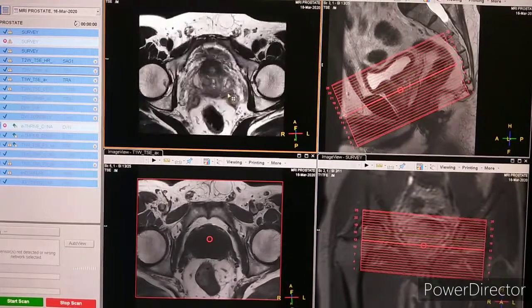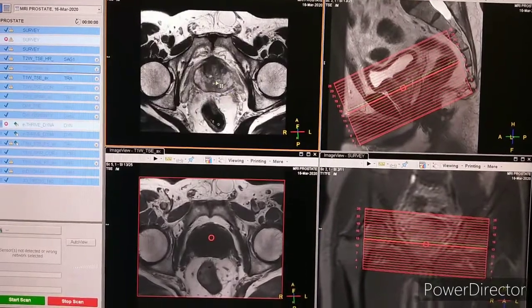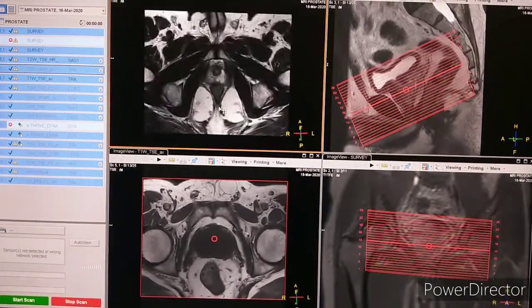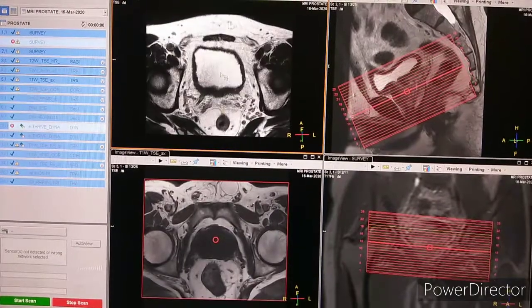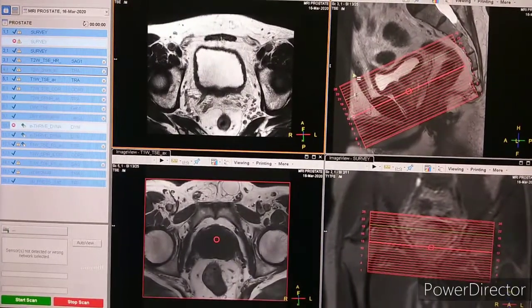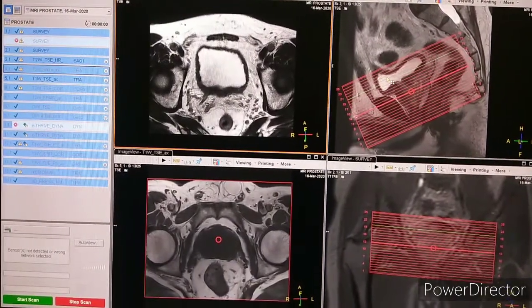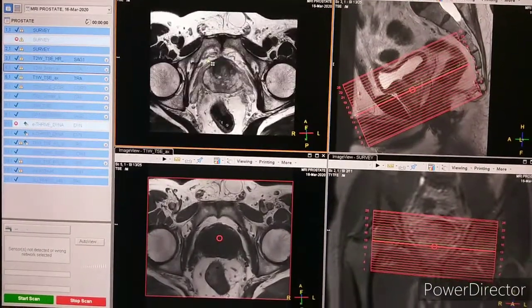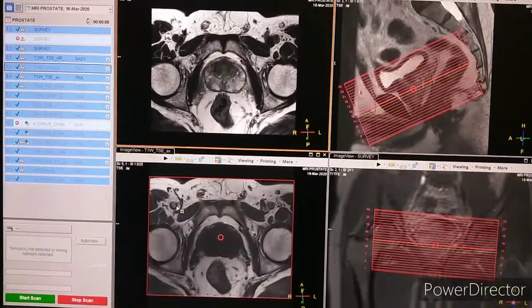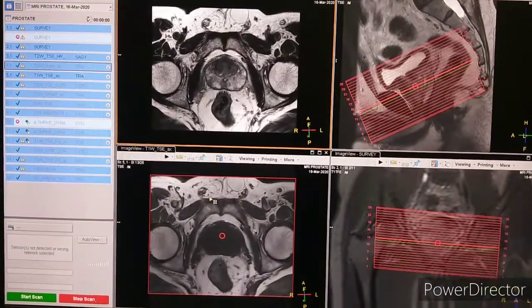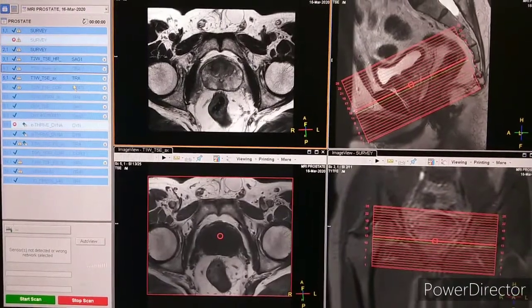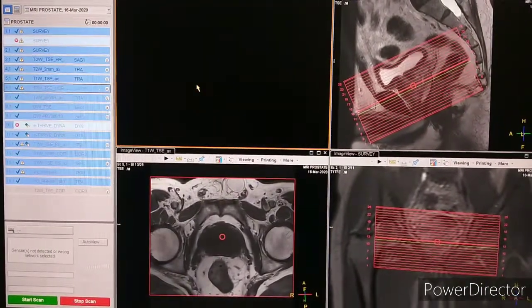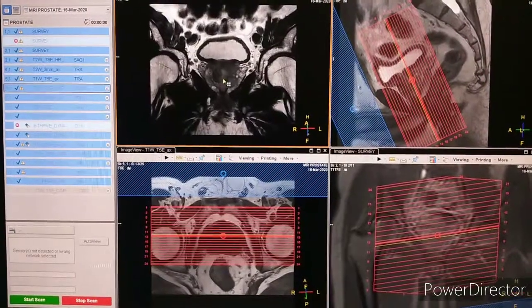You can see the planning of T2 weighted axial and T1 weighted axial — it is perpendicular to the urethra. This is the seminal vesicles, this is the prostate, this is the rectum, this is the urinary bladder. The same orientation applies for T1 weighted axial. Next is the planning of coronal.